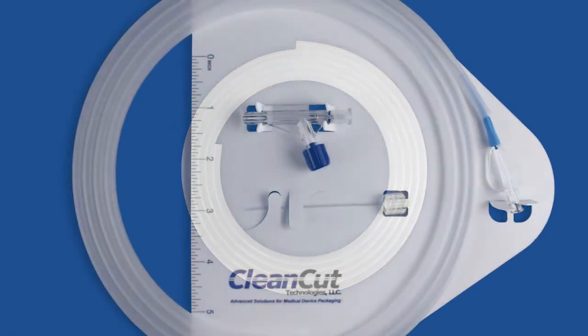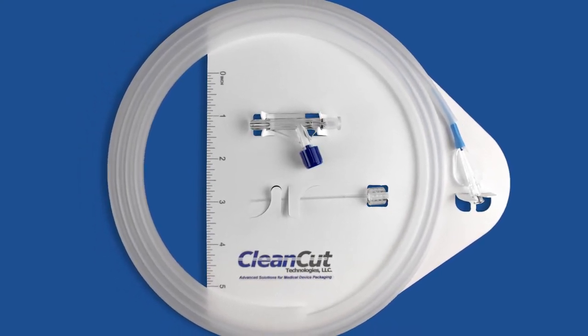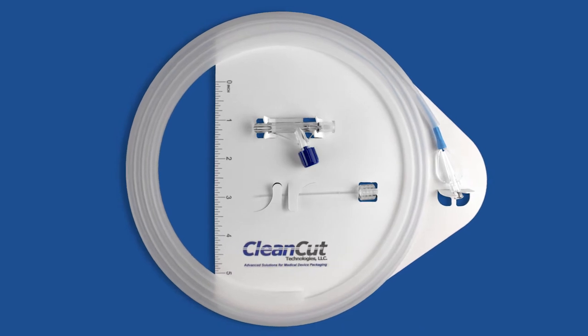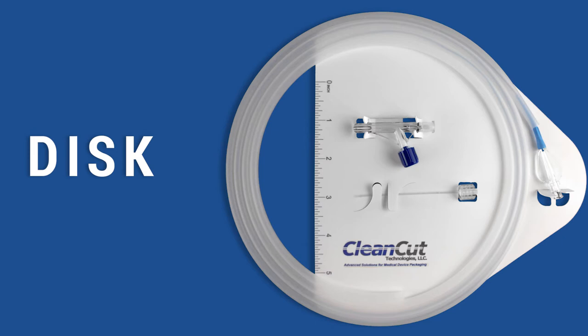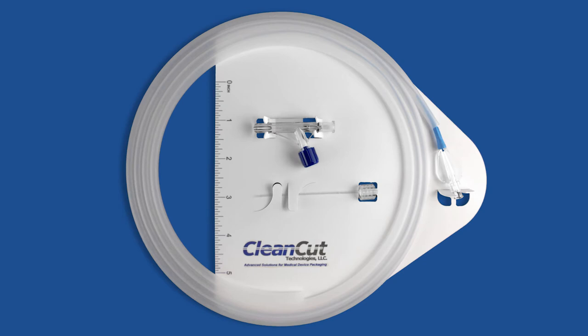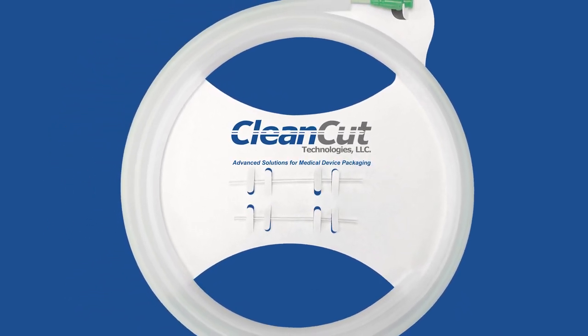While the clipless dispenser retains and protects guide wires and catheters, the addition of our backer card provides additional retention of procedurally related components such as syringes, luers, and adapters. Our Dispenser Integrated System Kit — or DISK — is a convenient all-in-one packaging system that completely eliminates secondary packaging for these items.